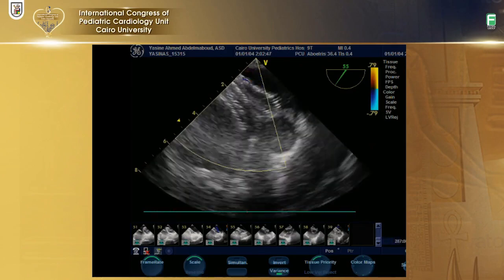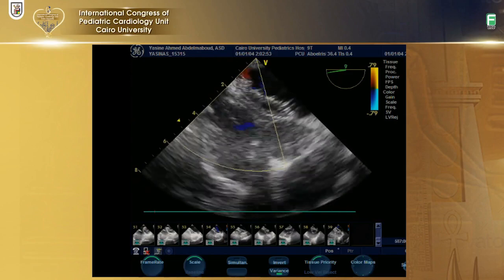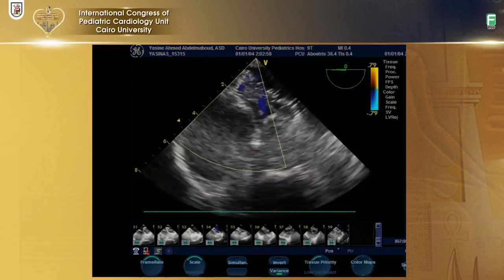I think it was a good choice. Despite the size, we didn't have any balloon sizing, and it was a big one that looked oval. But I think the size is very well satisfactory for all of us. Exactly. And I think the tricuspid is okay.